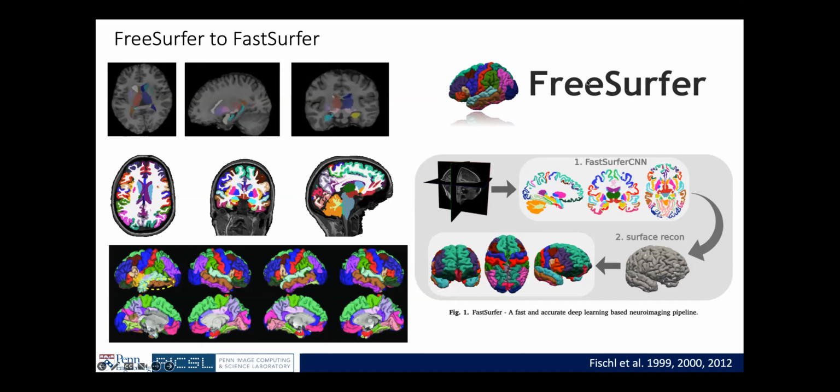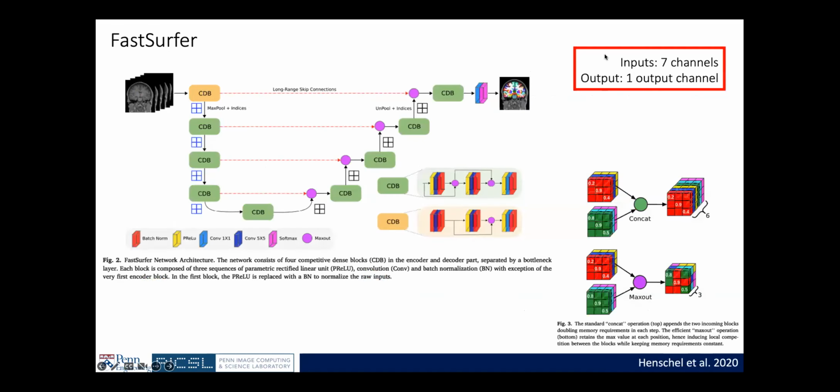Yeah, so not sure if you have seen FreeSurfer in the class before, or I guess you have. FreeSurfer is one of the most widely used toolboxes for anything related to in vivo MRI, especially structural MRI. And now they have a new toolbox where they automate the segmentation process using deep learning.